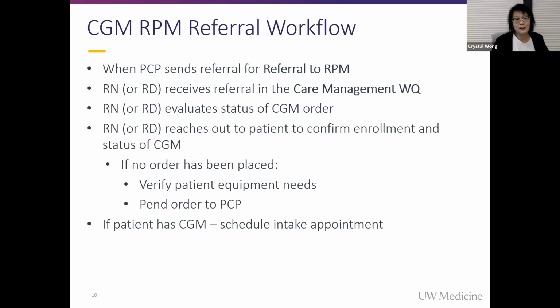Your hardworking care team. So when you send the referral to RPM, it goes to the care management work queue. The RN and RD will evaluate the referral and make sure that everything they need is in there, including reaching out to the patient to say, hey, Dr. Wang ordered you Freestyle Libre sensors. Were you able to pick that up? Okay, great, you did. Cool, let's schedule your intake.